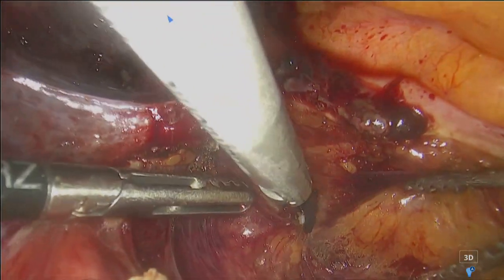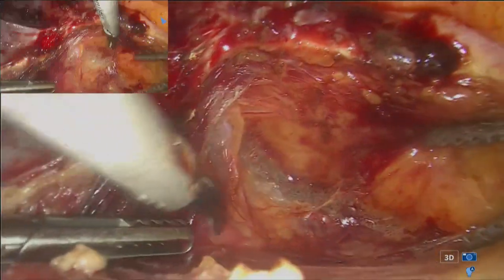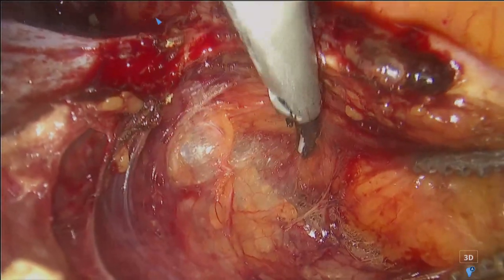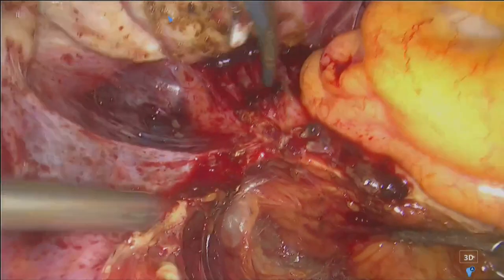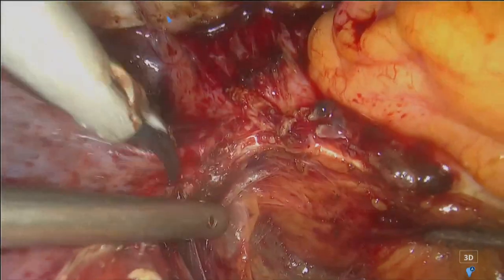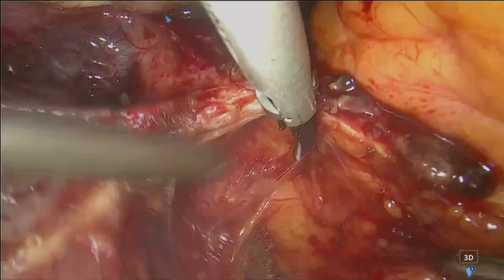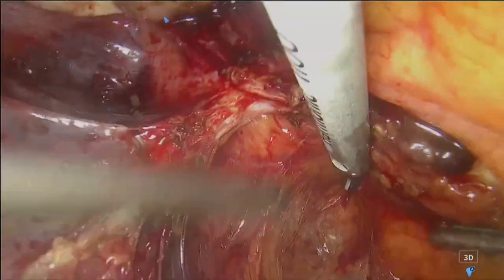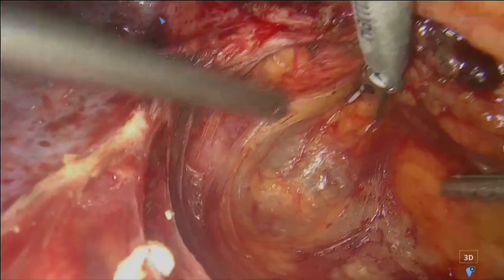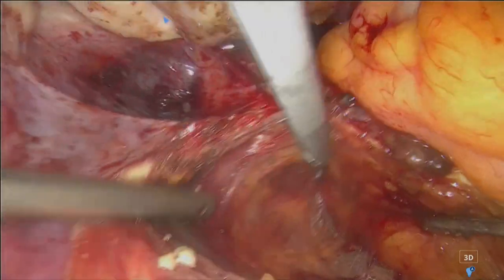And I'm arriving at the level of the hypogastric nerves on the left. So here you have the hypogastric nerves, you see this one, with all the small branches of the nerve, the vision is very clear. And if I work with the aspiration and the coagulation with the other button here, I do this kind of coagulation of the tissue and arrive better to identify the small neural part, the branches of the presacral fascia here. This is the presacral fascia with hypogastric nerves.